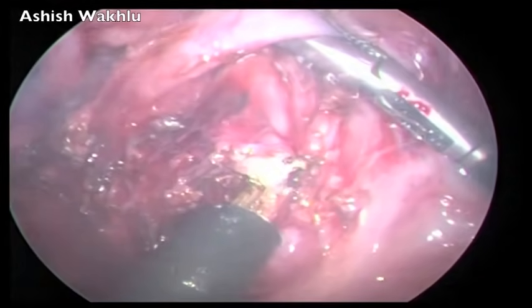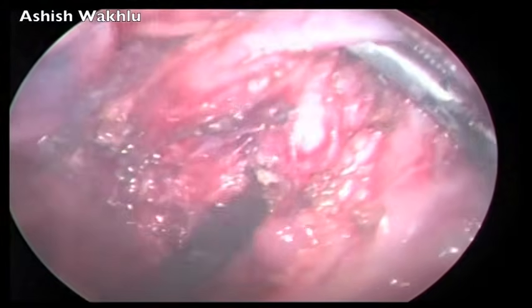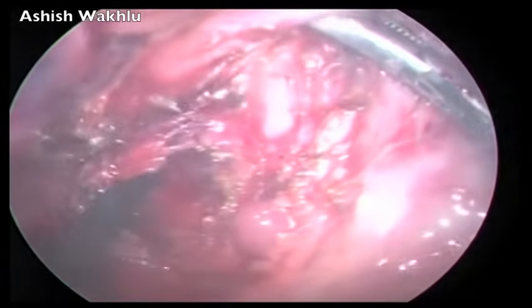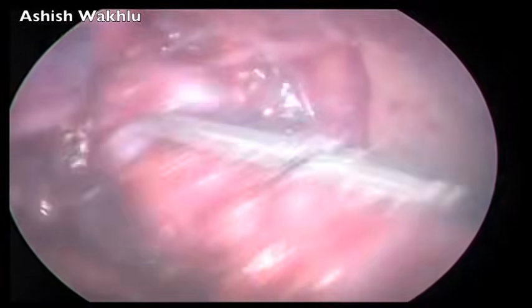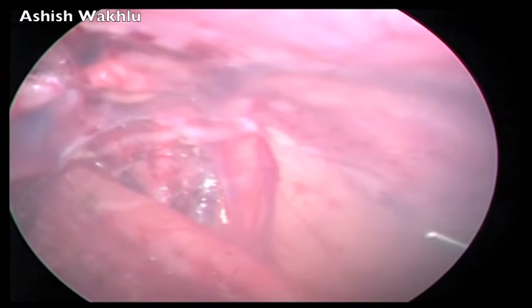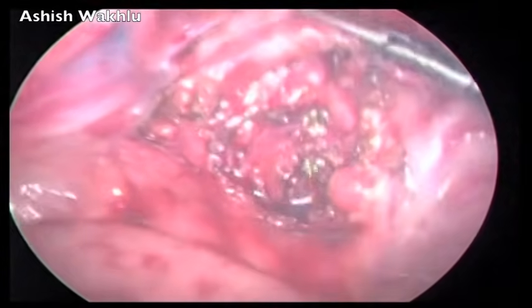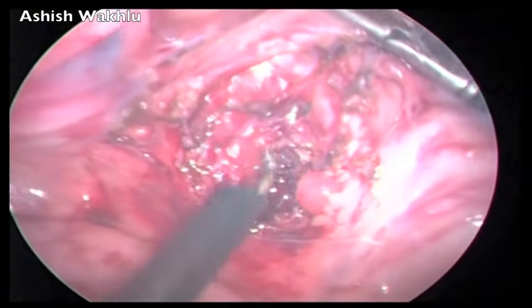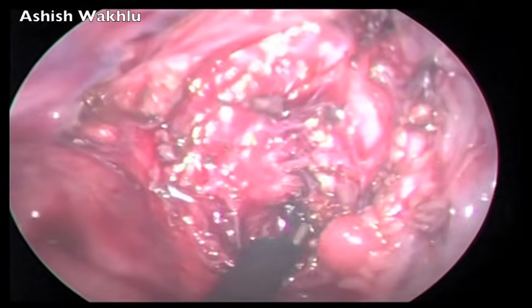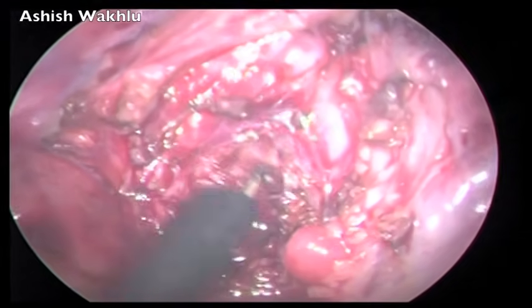Even when the aperture in the mesentery has been delineated, it is advisable not to coagulate very thick sections of the mesentery at a given time, but to work one's way through slowly until adequate mobilization is achieved. Some of the larger vessels in the mesentery usually do not get completely coagulated using the cautery hook and may retract into the mesentery to cause troublesome bleeding.